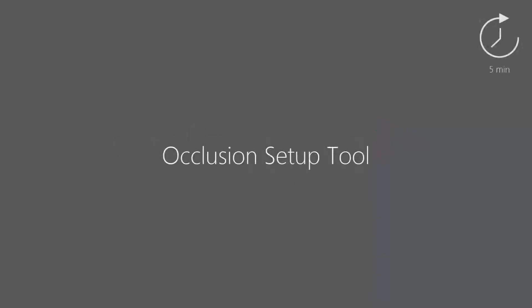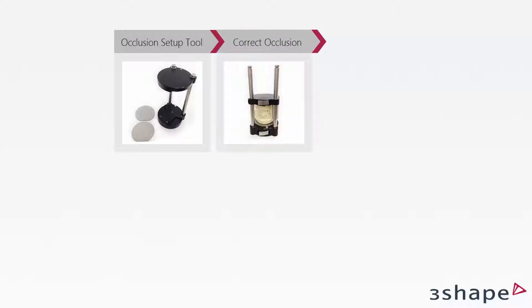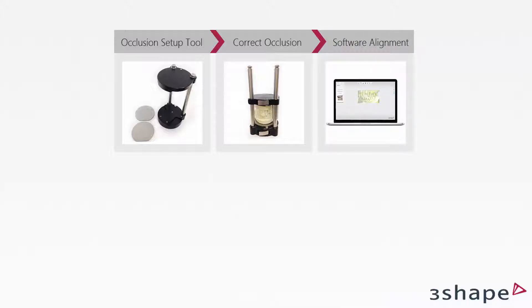In this video you will learn how to use the Occlusion Setup Tool. The Occlusion Setup Tool and its high-precision interface plates allow you to set up the upper and lower models prior to scanning and skip the bite scan. As a result, the scans will be automatically aligned in the correct occlusion in the software.